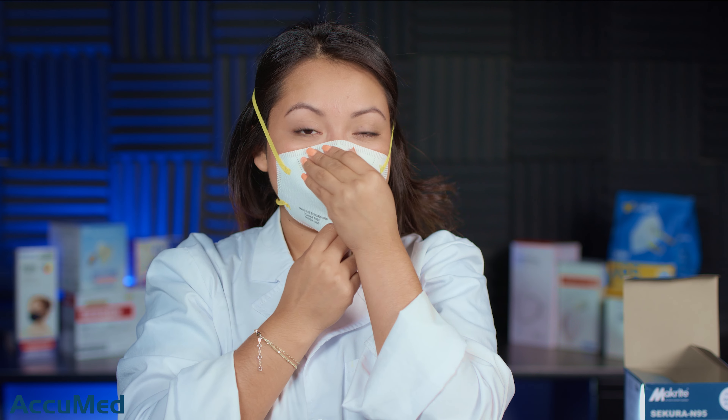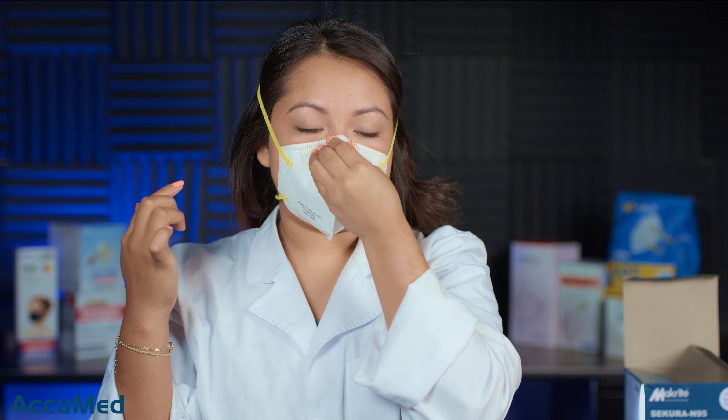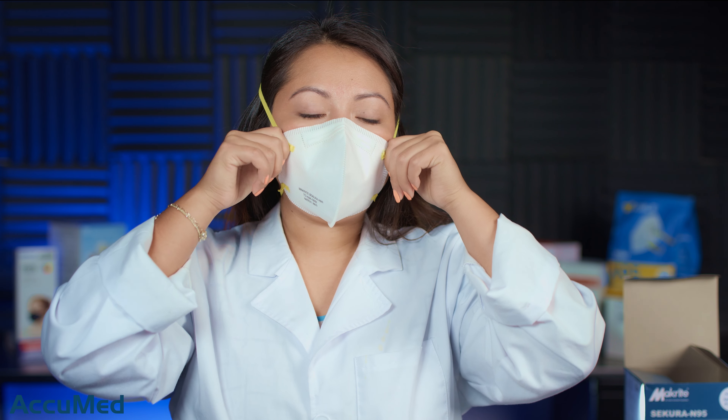Because of the straps, I definitely feel like this is a small fit because it is very tight on my face. The nose wire is actually pretty sturdy, so I am able to create a good seal with it. Although I am getting a good fit, it's not the most comfortable mask — the headbands are very tight and I can already feel them digging into my cheeks.